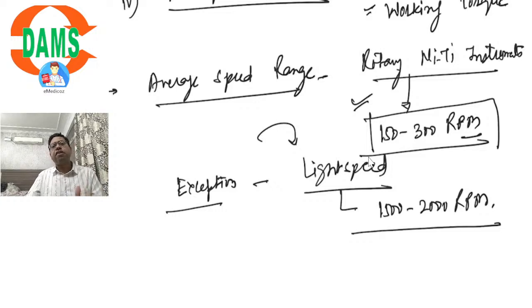These are the basics of your endodontic hand and the rotary nickel titanium instruments.